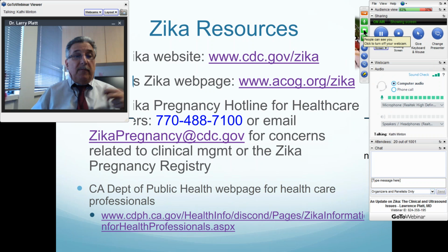There's far more calcifications. It looks a little bit more destructive, but in general, a lot of the things we see with CMV are similar. Certainly the changes that we see with the cysts within the ventricular system, but we really didn't see the same extent in CMV of microcephaly and the brain damage that has occurred in some of these cases.